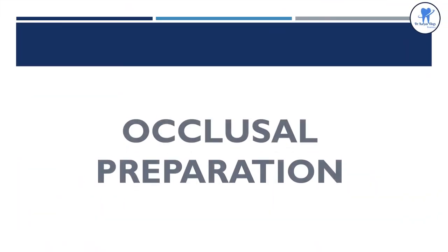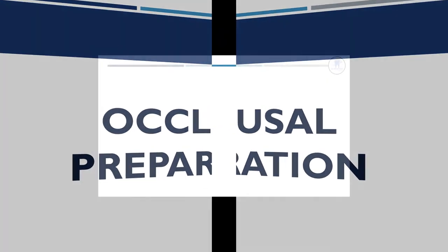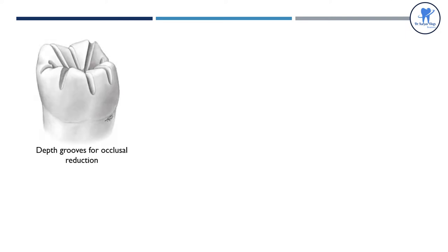Coming to the occlusal preparation, the preparation begins with guiding grooves or depth grooves. These are the depth grooves for occlusal reduction. The guiding grooves are deeper for the functional cusp.